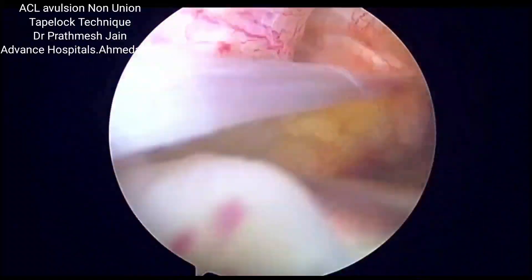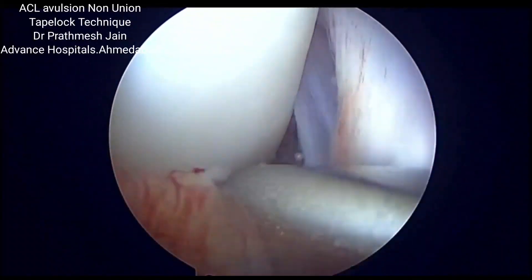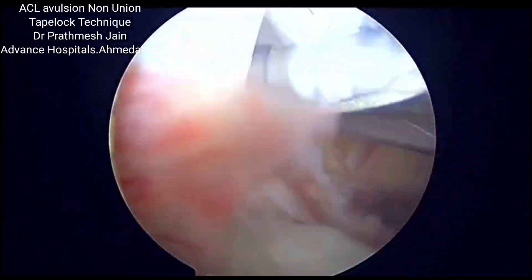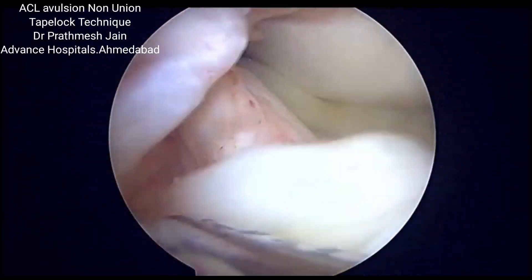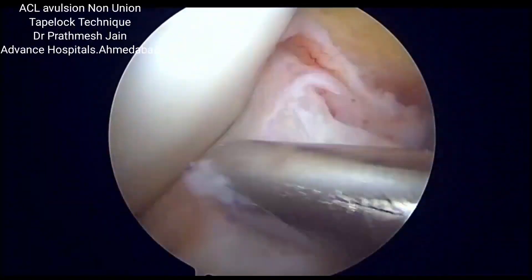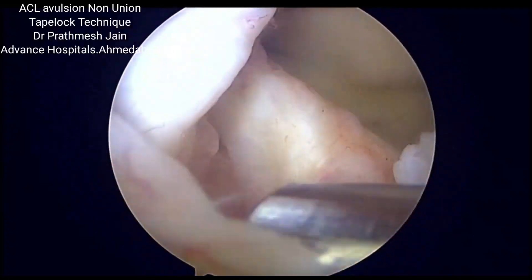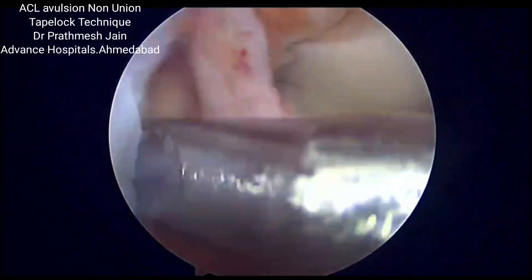Presenting a case of non-union of ACL avulsion. This is a case of untreated ACL avulsion one year back, which has resulted in a non-union fragment of ACL avulsion, resulting in instability and meniscus tear.